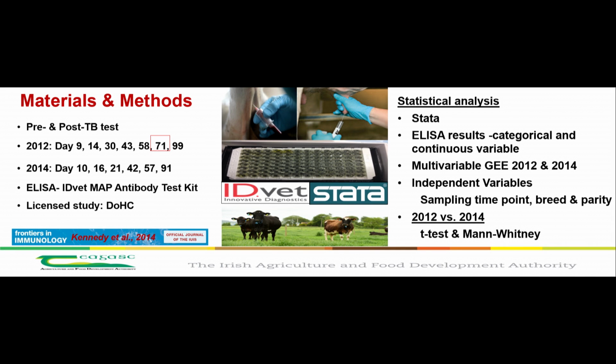So our materials and methods: serum sampling frequency increased both before and after the TB test period. In 2012, you can see we had multiple test dates following the administration of the skin test. In 2014, excluding day 71, we matched our sample time points to within 10 days of the original test dates. The test kit we used was the ID vet kit, and our study was licensed by the Department of Health and Children.